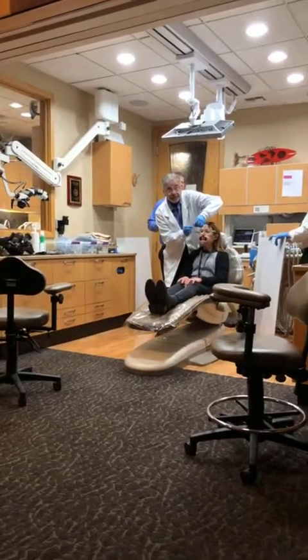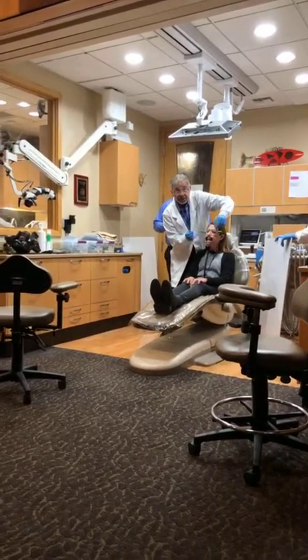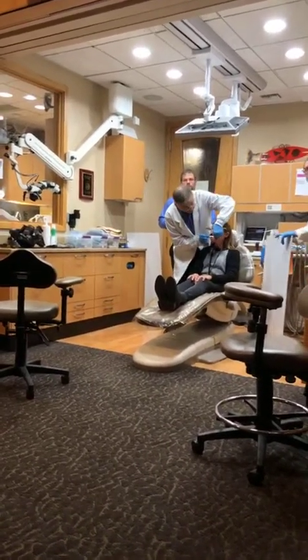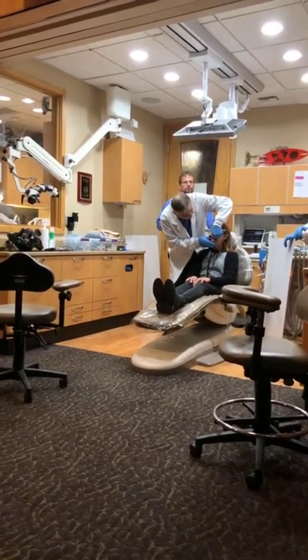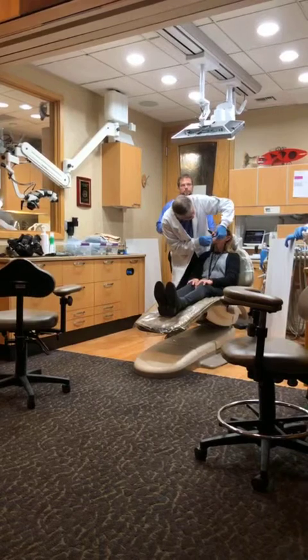If the patient has deeper overlap, you can slide the tip further back to open the vertical more. If the overlap is even more significant, we bought a box of clear saliva ejectors — seven millimeters in diameter — that'll open the vertical a fair amount. But for most people the saliva ejector is too thick; the air-water syringe tip works just fine. Go ahead and slide it back and have them close.